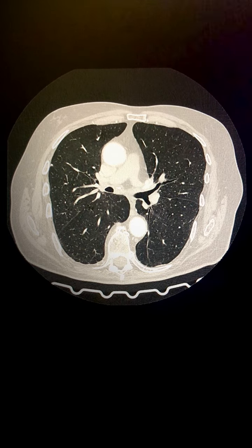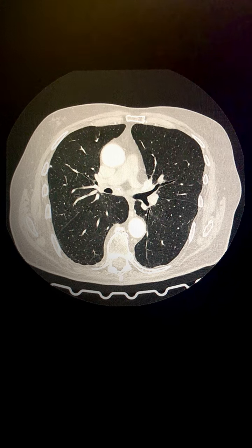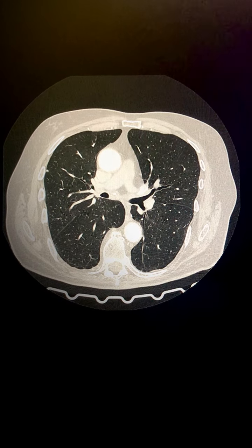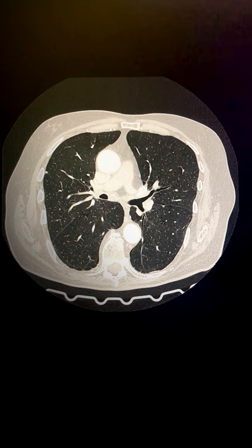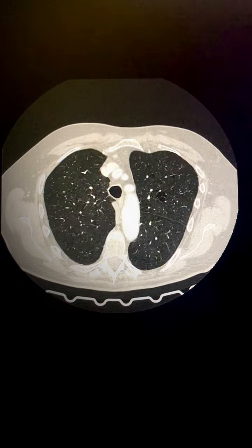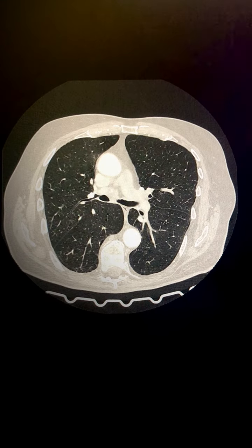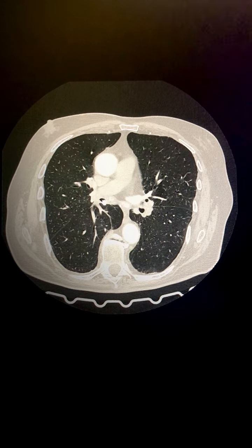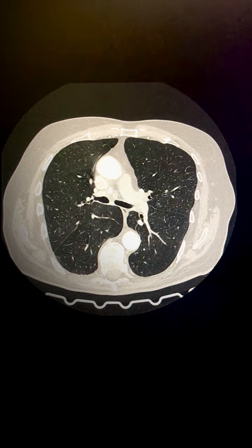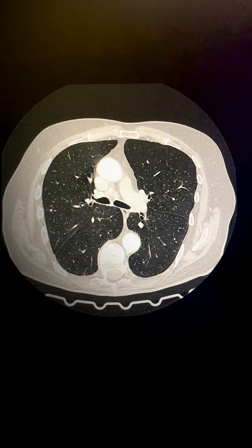In this video we are going to look at a mimic of a calcific pleural plaque, and these are called calcific pseudo-plaques. This is a patient who has pneumoconiosis. There are aggregated calcific lymph nodes in the hilar stations and subcarinal stations, and there are also small scattered calcific intrapulmonary nodules.